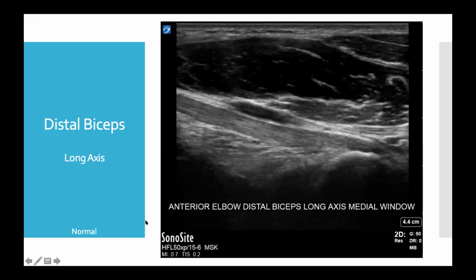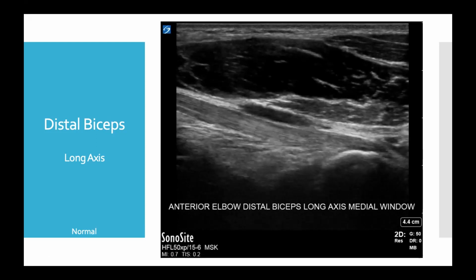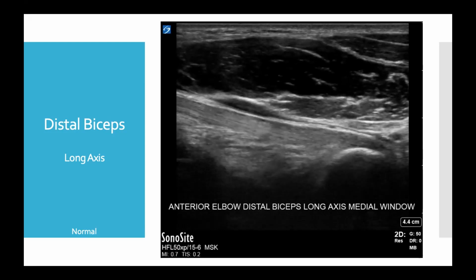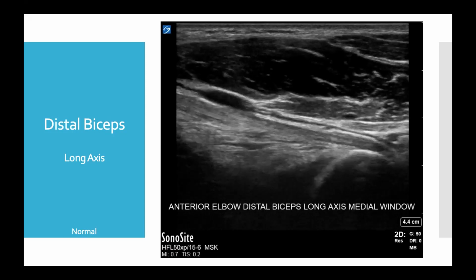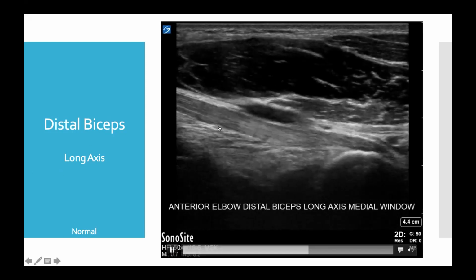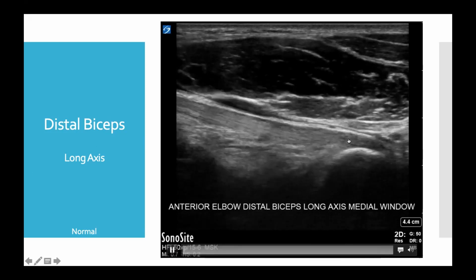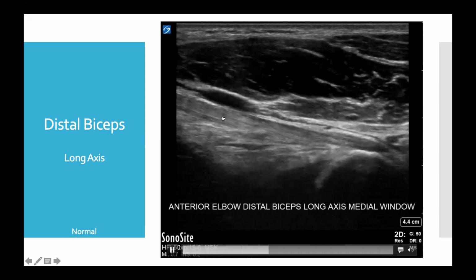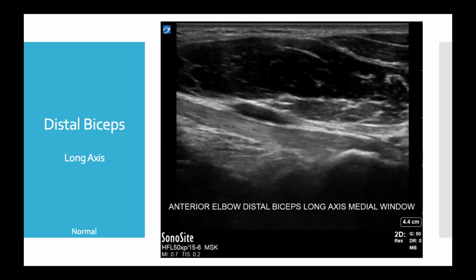One of the benefits I think we all can agree on with ultrasound is that the dynamic examination is very helpful when we're looking at a specific area or a structure. And as we can see here, supination will really show motion of the biceps tendon. It'll show it tightening and getting taut with movement of the forearm.